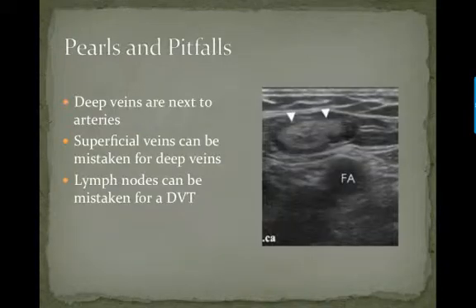Here are some pearls and pitfalls when completing a DVT study. First, you want to make sure that you are identifying deep veins. Deep veins are next to arteries, as we saw in the popliteal example. Superficial vessels can often be mistaken for the deep veins, so you need to make sure that you're looking at a vessel next to an artery.